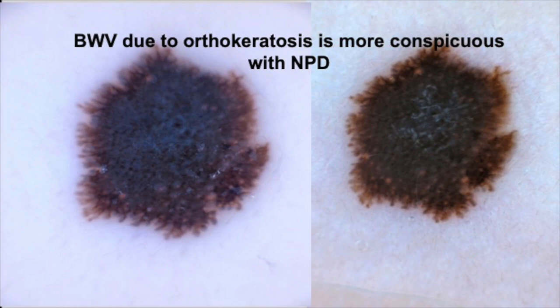because you see streaks. Two, I see a blue-white veil here, but it disappears in the polarized light. What that means is that the blue-white veil is due to orthokeratosis. Polarized light looks beyond. It doesn't see the top layer of the skin. It sees beyond. So it doesn't see the veil. So since the white is gone, I know that's orthokeratosis. So I can predict the pathologist will see orthokeratosis on the biopsy.